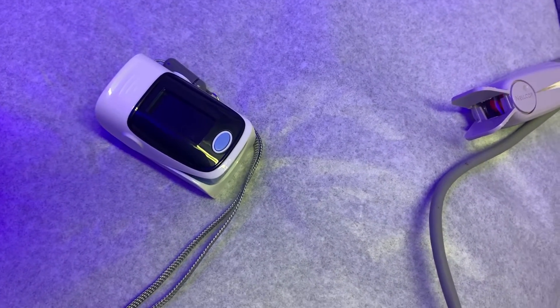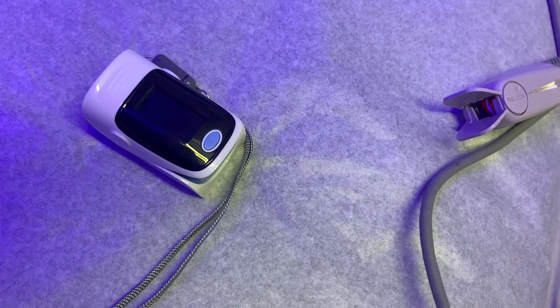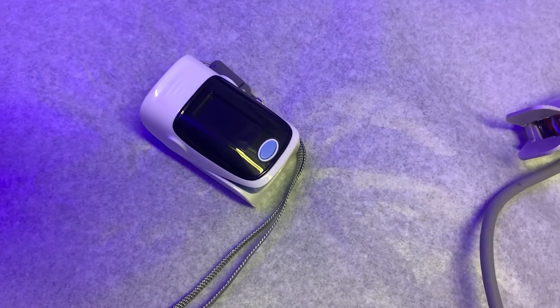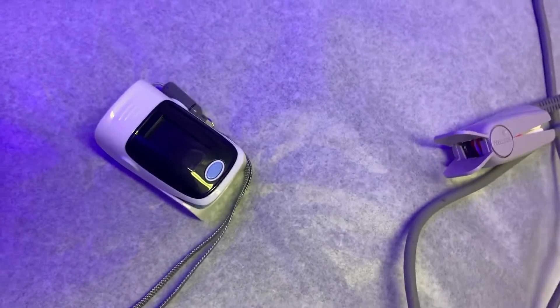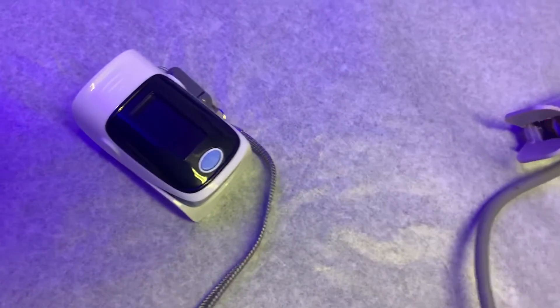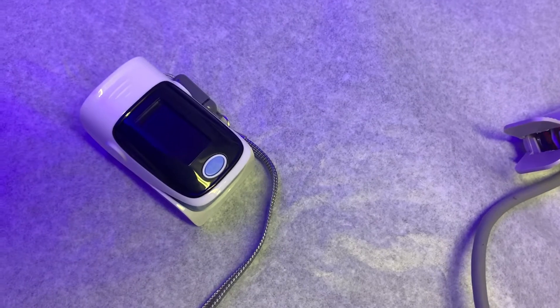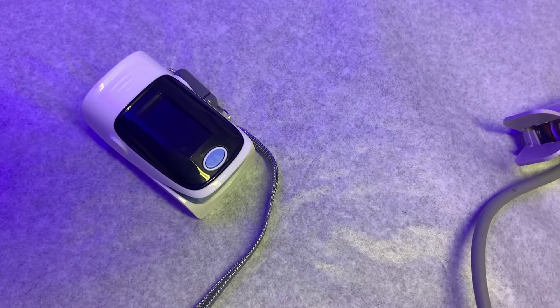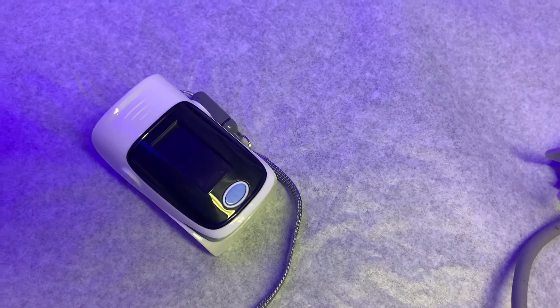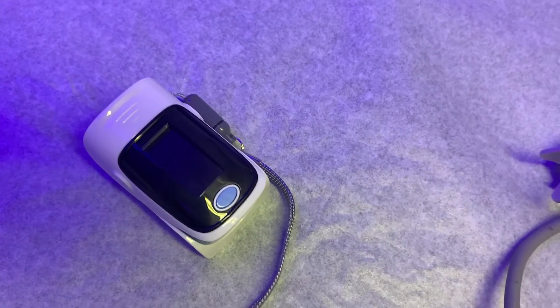When the number is around 70% to 80%, that's the time we usually try to take the patient to the ICU and intubate them — there are other elements we check as well, but this is where we start. You can have that device at home and monitor yourself, looking for readings in the 96 to 100% range. If it goes lower, you know you might have a problem.